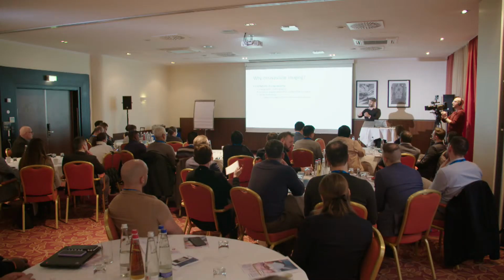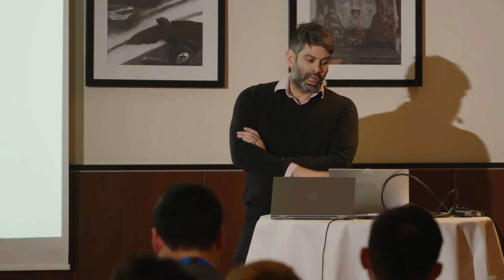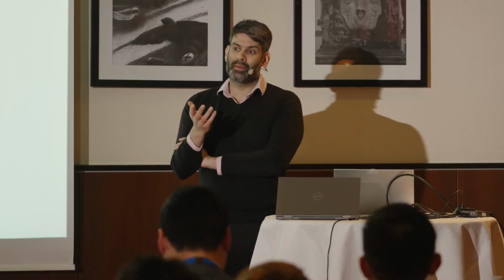You can really underestimate stenosis in the anterior-posterior plane, for example, if you're just doing it lateral. It would be nice to do angiograms in multiplanes as we go down, but then, of course, you get increased time, increased contrast dose. And angulation of arteries can really distort true diameter measurements.